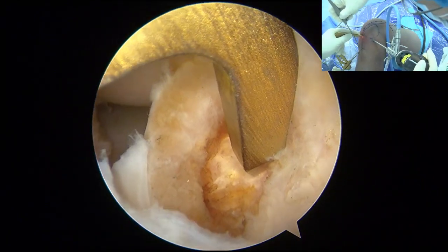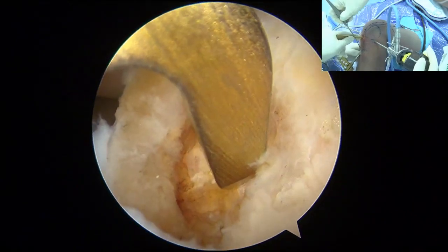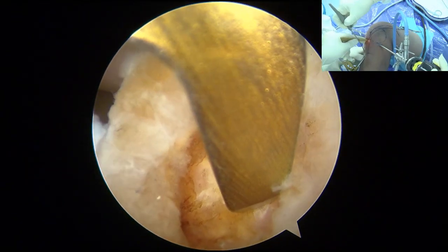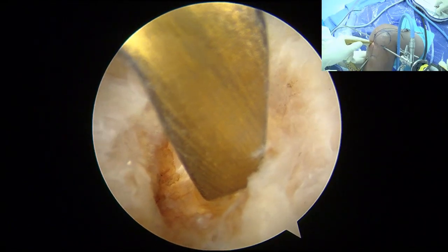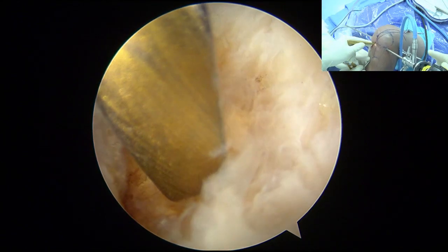But when we put the screw, we put the screw eccentric, so that we push the graft to the anterolateral. And nowadays, your tunnel is really anterior. So if you make the tunnel too short, you can break the anterior cortex. So I prefer to go 65 degrees, okay? And your tunnel should be at least 4 centimeters.